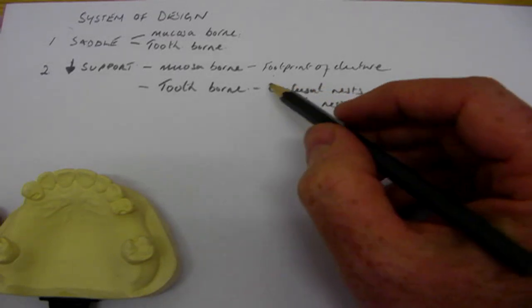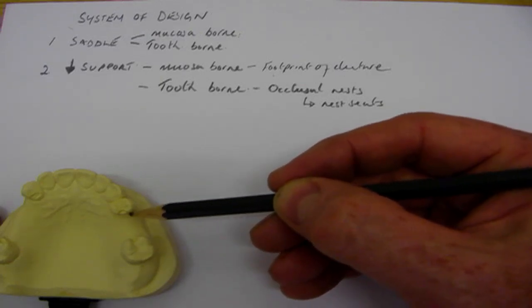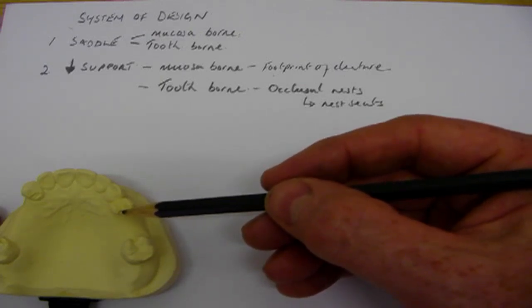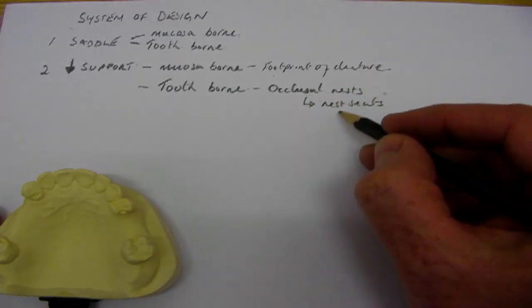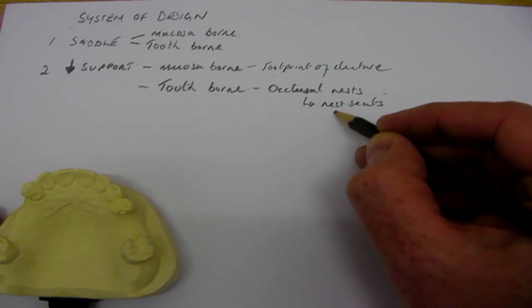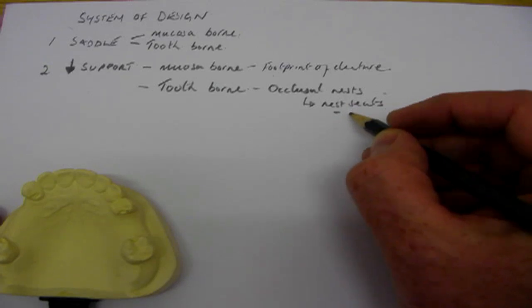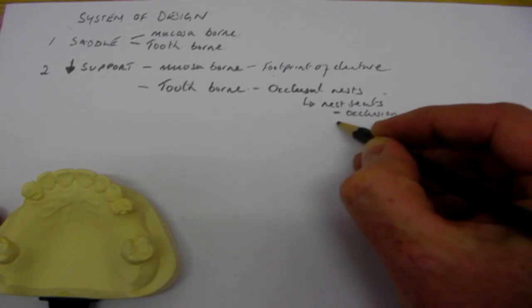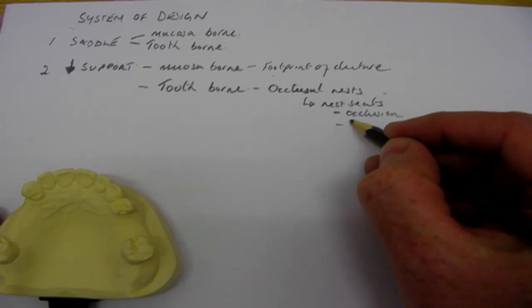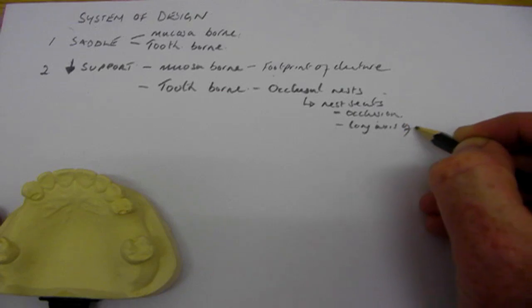They transmit the load from the artificial tooth through the metal framework through a small metal occlusal rest that sits in an occlusal seat on the surface of the tooth. And we have occlusal rest seats so that they don't interfere with the occlusion, and also to transmit the force down the long axis of the tooth.